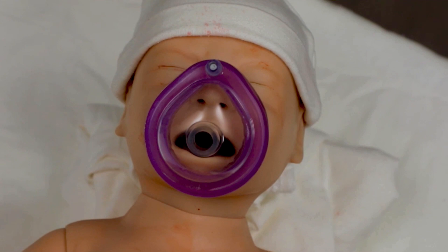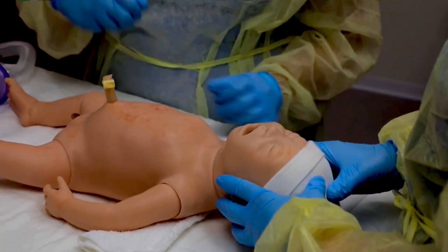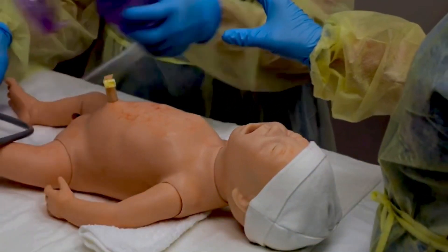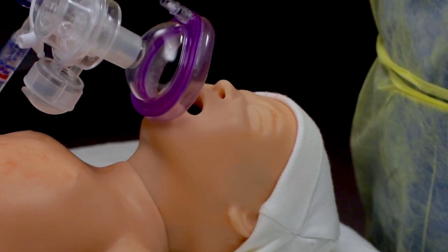The mask should rest on the chin and cover the mouth and nose, but not the eyes. Position the baby's head in sniffing position. A shoulder roll may be helpful to lift the shoulders. Cup the chin in the mask, then bring the mask up and over the mouth and nose.